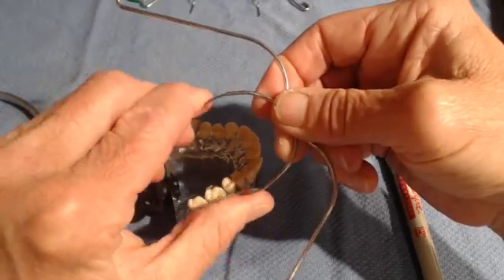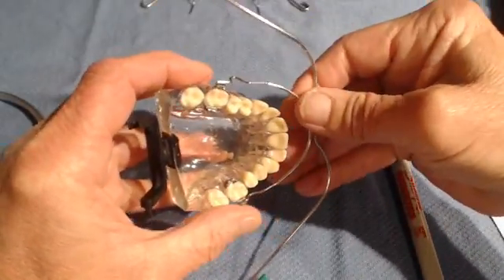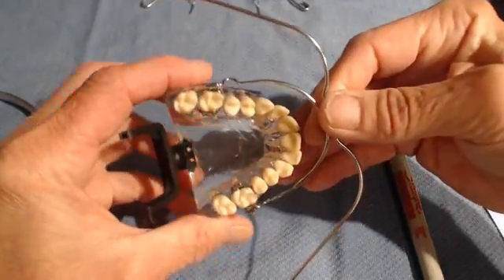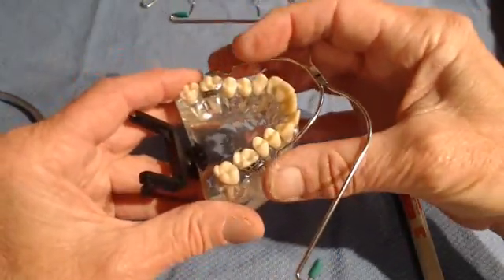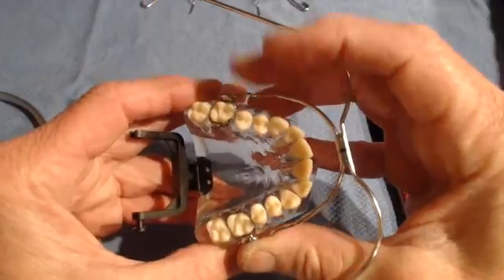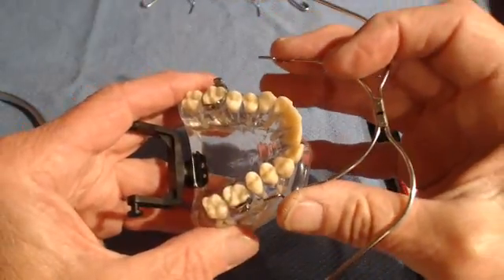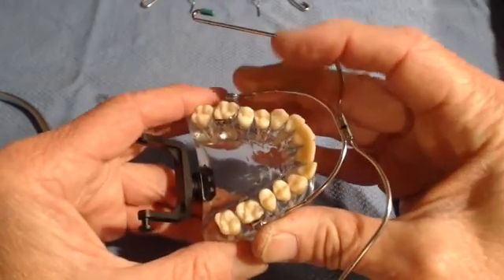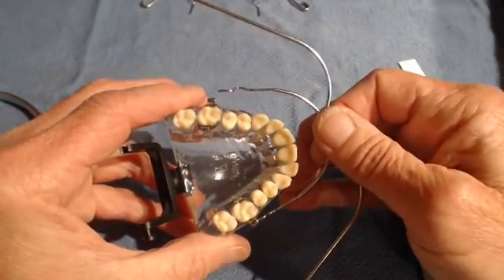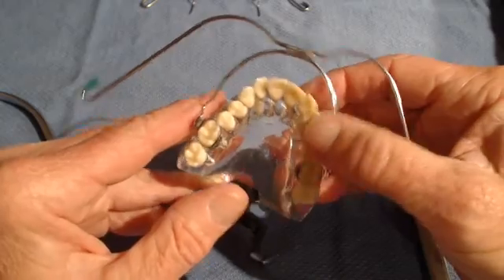That might be a little over-expanded, so let me compress it just a bit more. When I do this delivery with a patient, I say, 'Can you feel how there was zero force when this went into the molar tube?' and he says yes — that's exactly how it should feel. When removing the face bow, you want to compress the U-loop slightly, then roll one side out and gently walk the other side out — smooth as glass. The reason headgear bands get debanded from the tooth is because the patient reaches in and jerks it out; done correctly with a gentle compression, it should be smooth as glass.